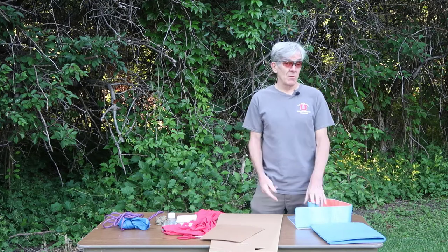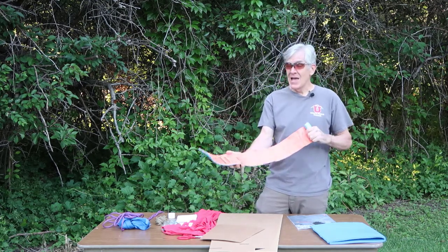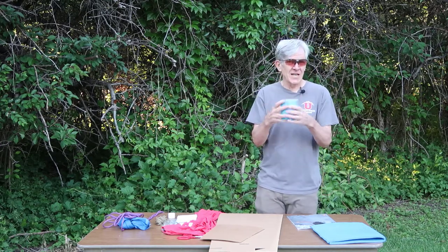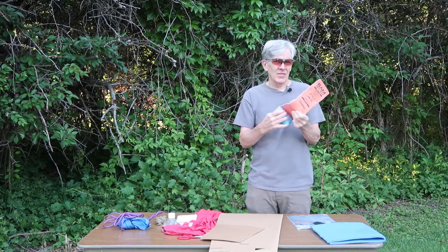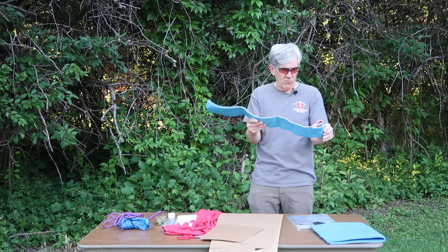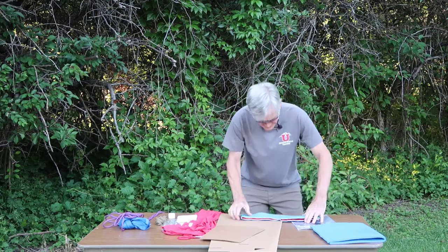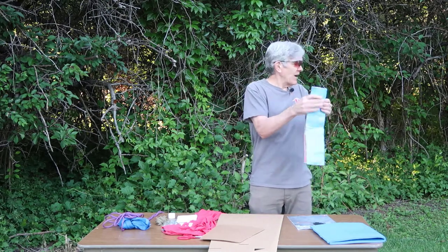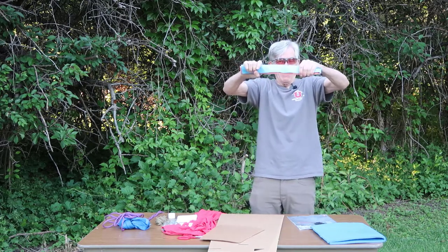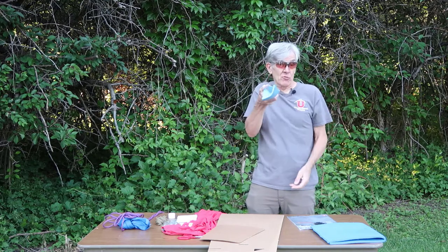Let's talk about some splinting materials we might have access to in the wilderness. The first is a commercial splint — SAM splints are super lightweight, so it's not uncommon to find them in first aid kits. It's an aluminum bendable metal with a thin amount of padding. It's not rigid when flat; you really need to get it on two axes. If you create just a little V or U shape to it, it becomes very rigid. It does require a little self-engineering to create the rigidity.